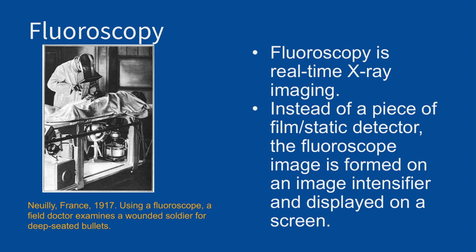This used to be achieved using a phosphorus screen. The phosphorus actually interacts with the X-rays and creates a glow. You can see here in this picture this physician from 1917 during World War I, where he was using one of the early fluoroscopes to remove a bullet. And again, there's a theme here compared to one of the first clinical applications for X-rays. It's a little bit different.